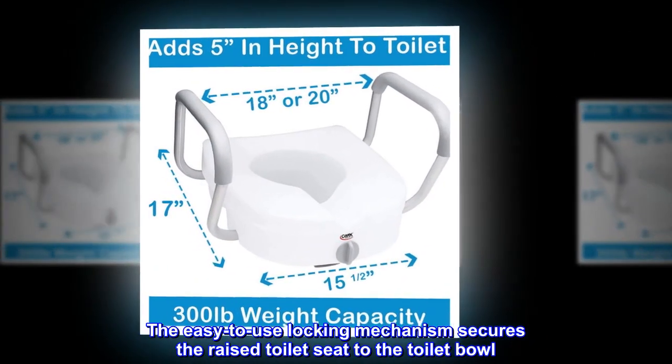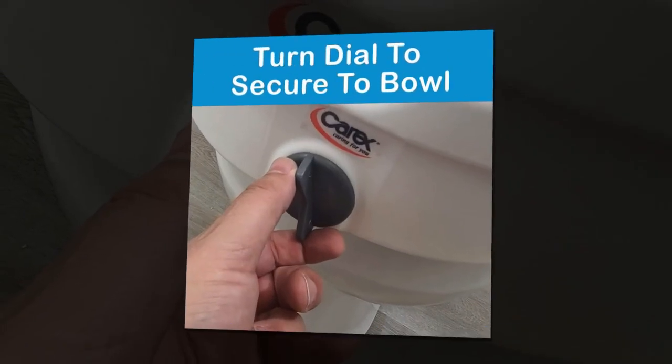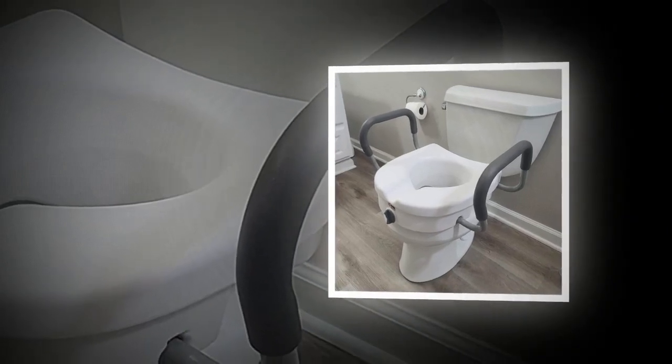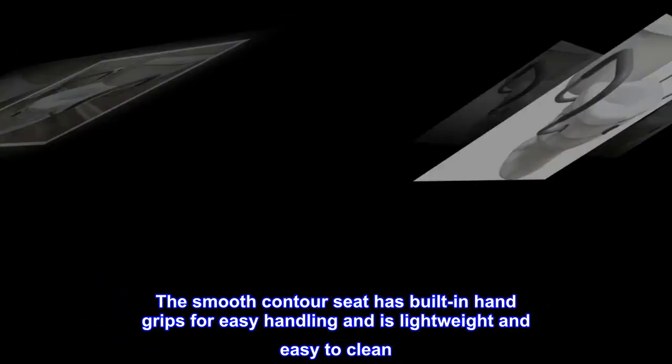The easy-to-use locking mechanism secures the raised toilet seat to the toilet bowl. Toilet seat riser comes with padded armrests. The smooth contour seat has built-in hand grips for easy handling and is lightweight and easy to clean.